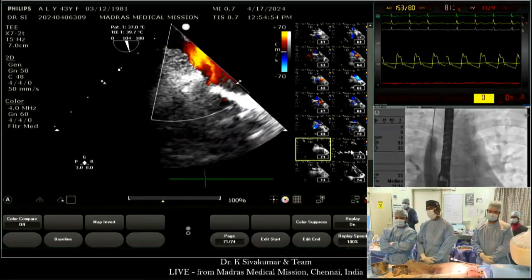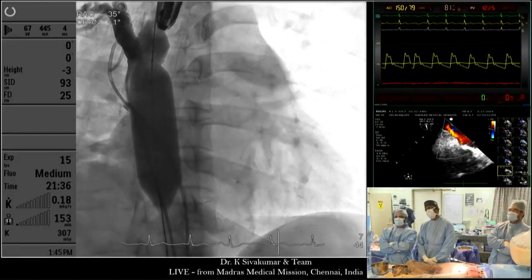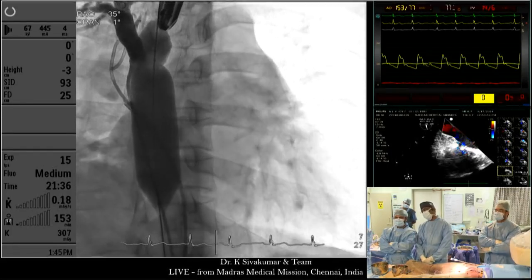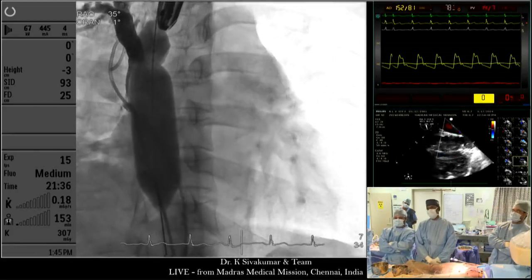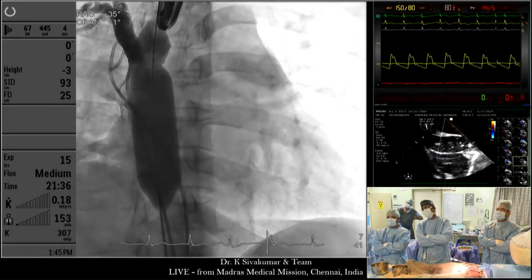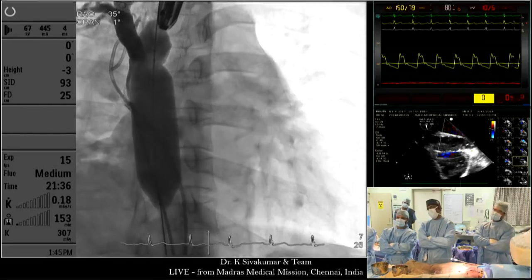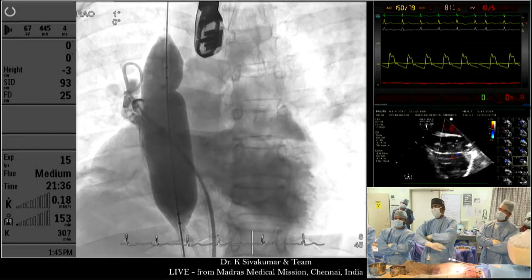At this point, we decided to do an angiogram. Show the angiogram. So this is the right additional pulmonary vein that is being injected. We wanted to see whether the right upper additional pulmonary vein will also get committed towards the left atrium, even though that is not expected because it was draining clearly more than 1 centimeter above. But we just wanted to see the location. So this balloon is occluding that right additional pulmonary vein. Next picture. At this point, we checked for our main pulmonary vein.